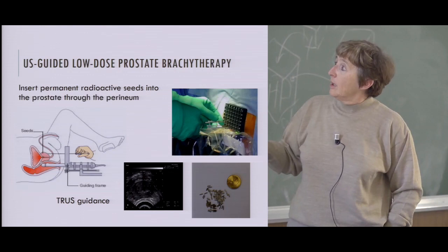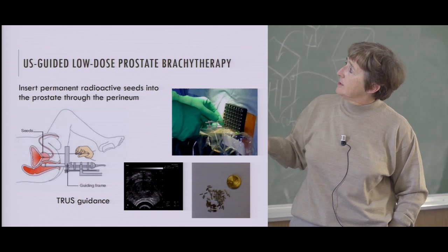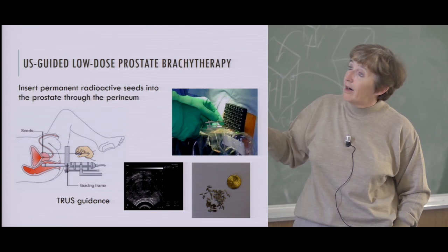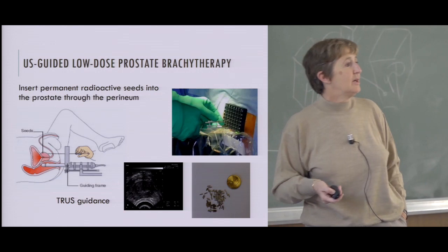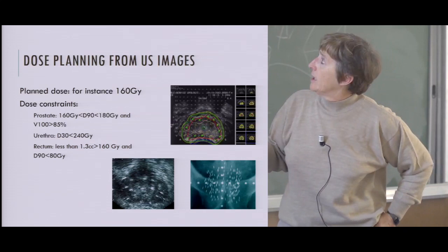and where you place them, of course, depends on which treatment you want to deliver. And this is based also on ultrasound images, and you can see that the seeds here are inserted through needles, which are inserted through this kind of template. It's like a naval battle. You say A1, B2, and you have to place different needles with very precise positions.